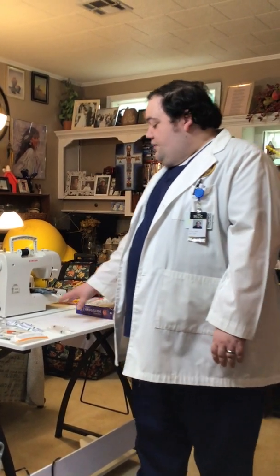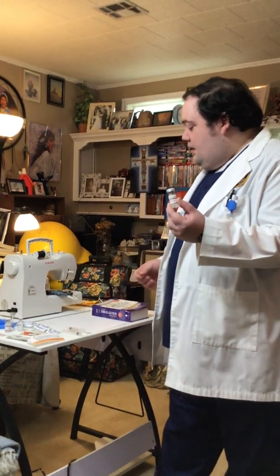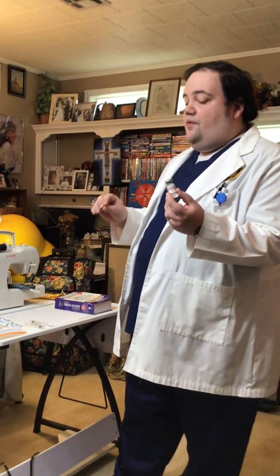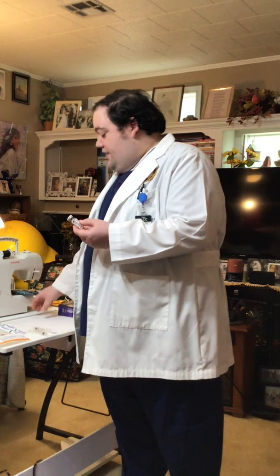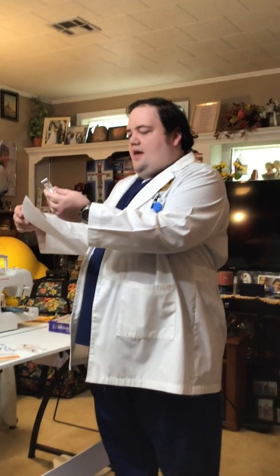Having done that, I'm going to prepare to draw up the medication. Now this is very important. I'm going to look at the order. I'm going to find the corresponding vial or ampule that the medication comes in. At this point, I'm going to compare it no less than twice. I'm going to do that by looking at the medication, the vial, the order, the vial. I'm going to match the name, make sure it's exactly the same name.